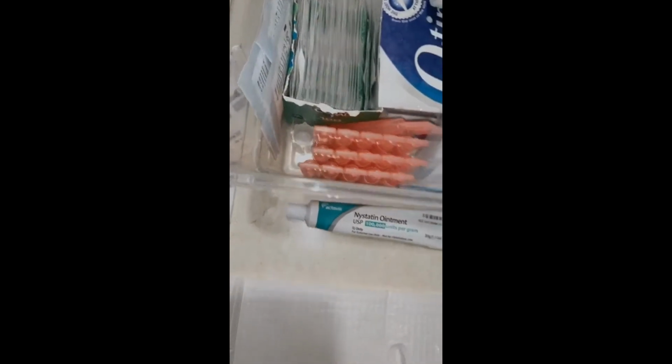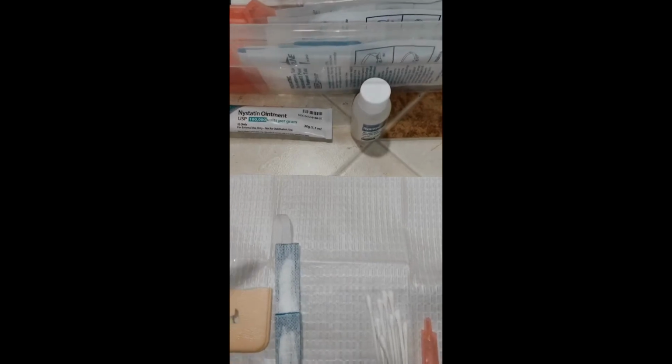And then his ointments if he needs it, and the powder, what's on here, that helps keep his neck dry and not get irritated as much. So we change this every day.